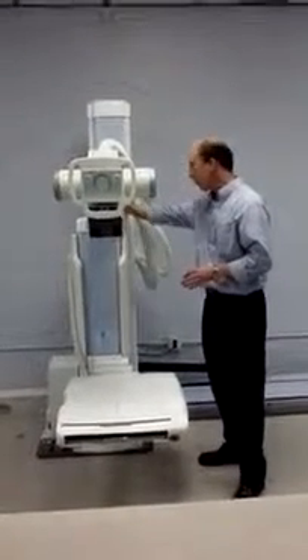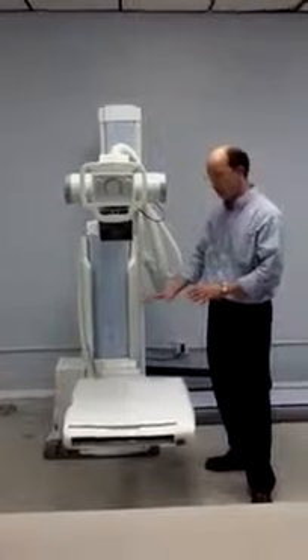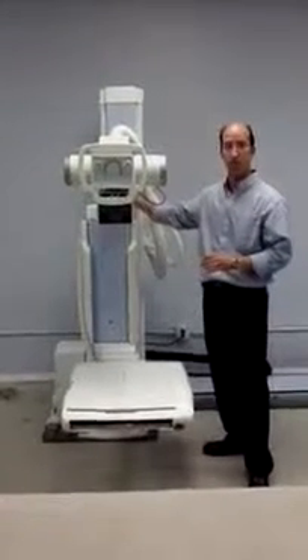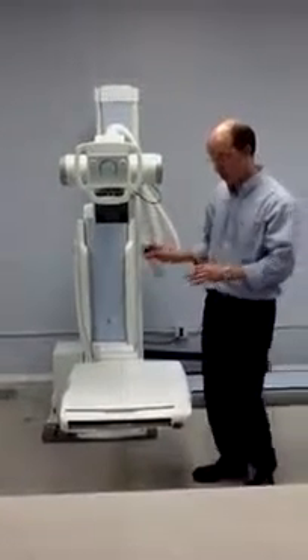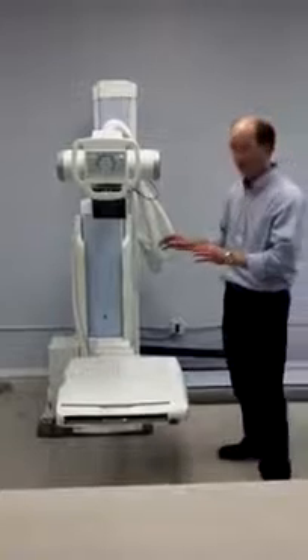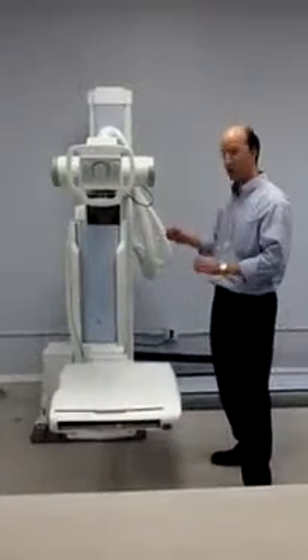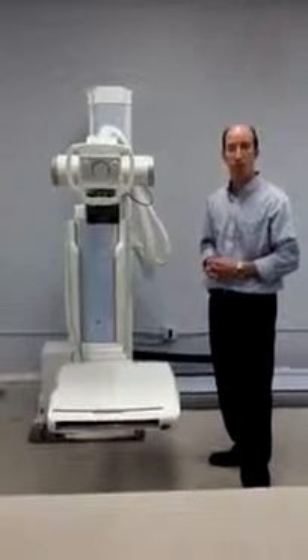All of the movements within the system are controlled by collision protection, so there is really no way for the technologist to bump the image receptor into the tube stand. However, when it is in the horizontal position there is no collision protection, so the technologist does have to be mindful of running the tube stand into the image receptor. And that is the basic movements of the FRS system.